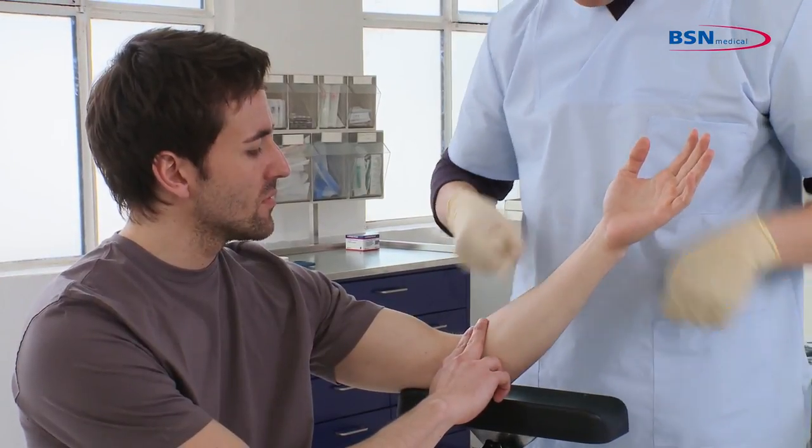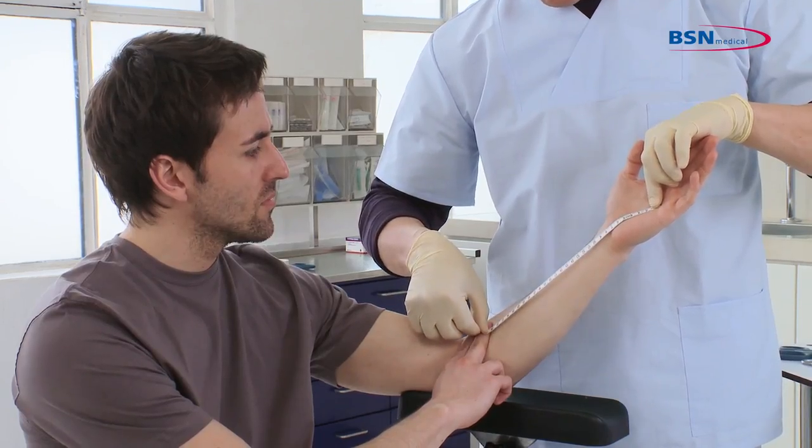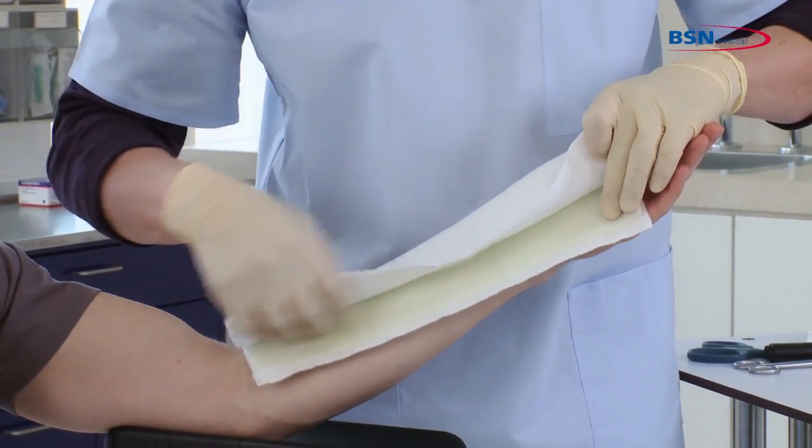To begin, measure from the palmar crease to two finger widths distal to the antecubital. Then cut the desired length of the splint and place the splint on the patient's arm.